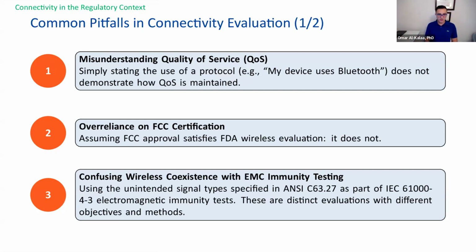Another very common pitfall is the over-reliance on FCC certification. FCC and FDA share an overlapping responsibility in regulating wireless medical devices. Now, if you have a medical device and you have a wireless module, I'm willing to bet that it already has an FCC certification that was provided by the OEM of that wireless module.